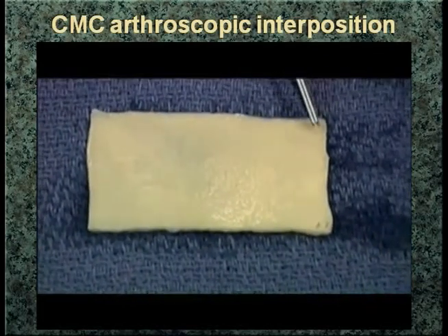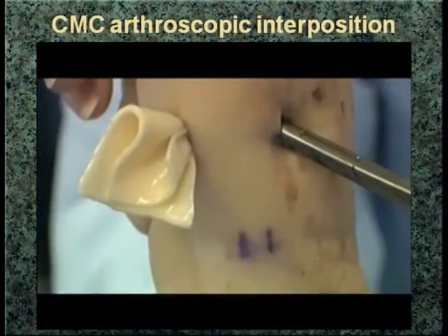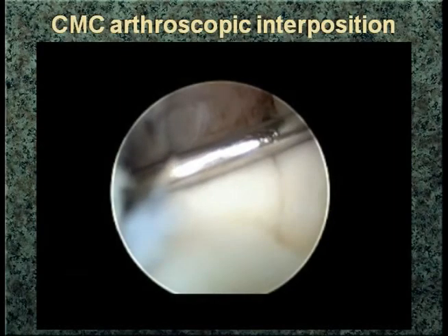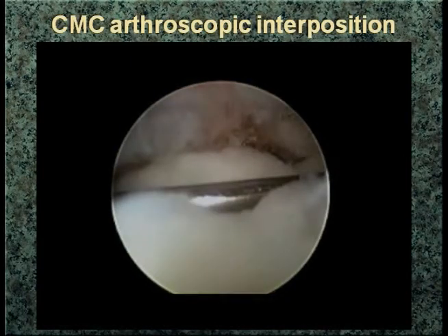Clearly what we're doing here is not recreating normal anatomy. We're flattening out the trapezium and taking the saddle shape out of it. Here you can see a dermal graft — typically I'll use it folded in half, giving about a 3-millimeter thickness. My nurse called this 'putting Kleenex back in the box' — you're trying to pull the graft in. It can be a little trying, but you don't want to make the portal too big. I do not use a pin to hold the graft in place, but I hold the thumb abducted and reduced while my assistant places the thumb spica cast, because if this moves too early in the postoperative period, you will not get adherence of the graft to the denuded trapezium.